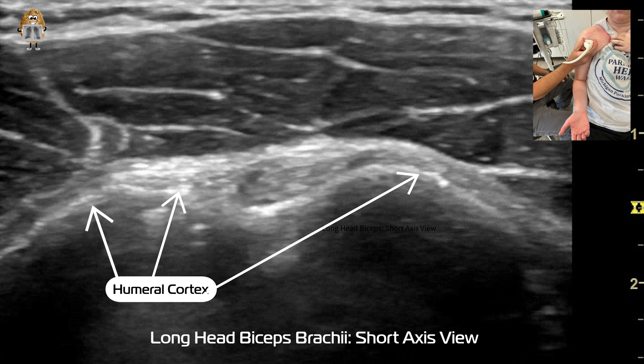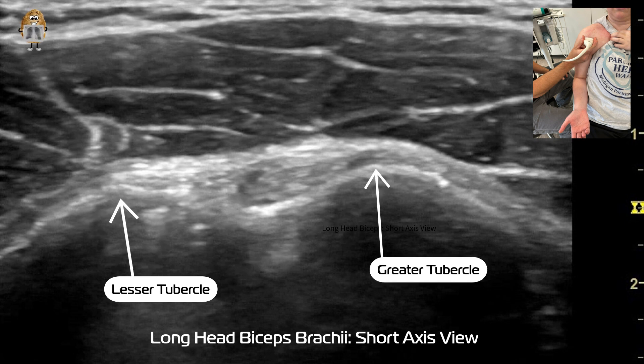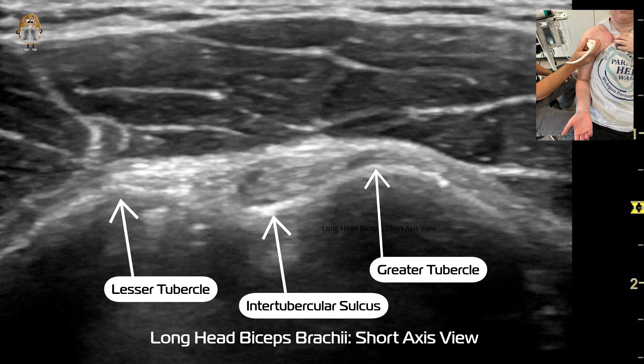When we're doing musculoskeletal ultrasound, you want to start by identifying the cortex. You can see the humeral cortical line there. We can identify the lesser tubercle, which will be more medial, and the greater tubercle, followed by the intratubercular groove — also called the bicipital groove or sulcus.